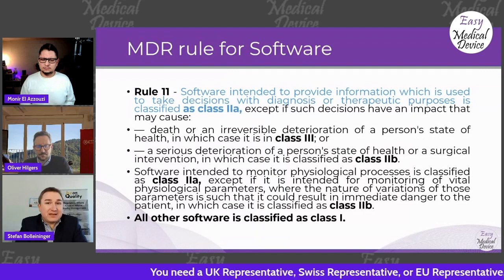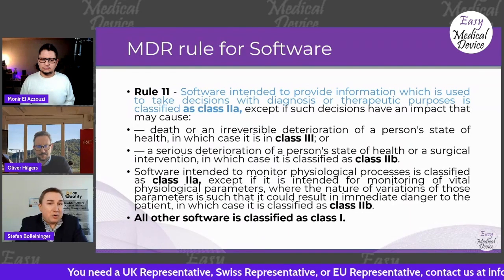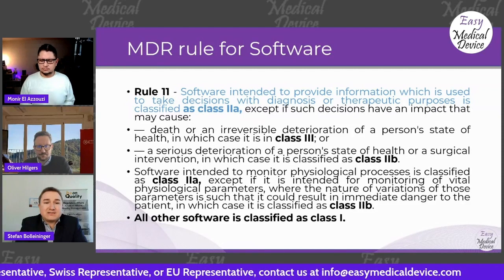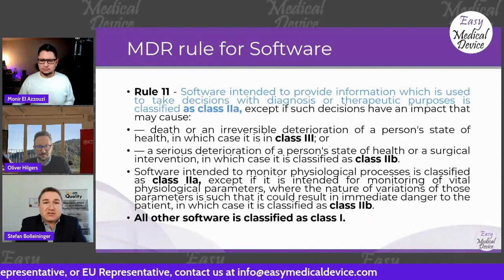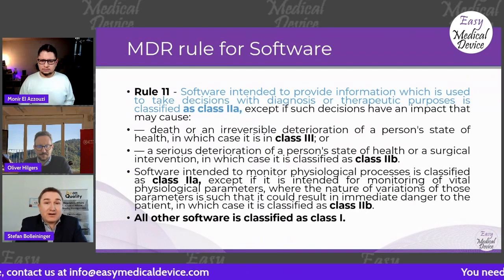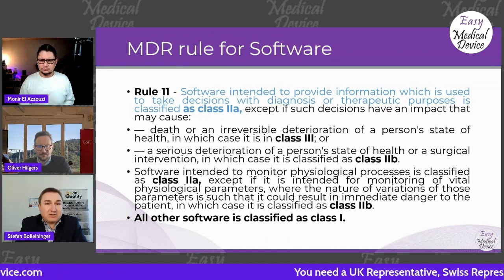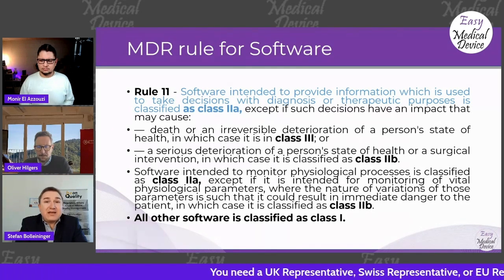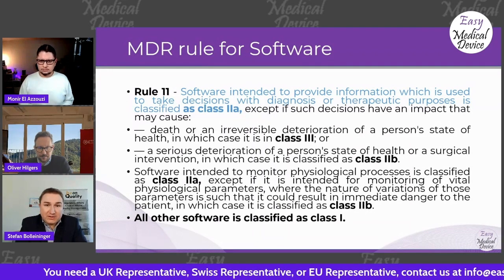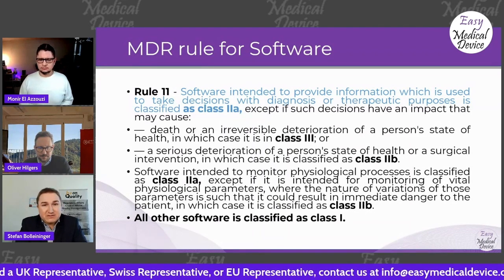And that means you need to have someone who has the competence, the knowledge, and the awareness about taking a therapeutic or diagnosis decision. And that is our first attempt, where I very strongly believe this is one of the main things we need to encounter. And based on that, it is up to the manufacturer to decide, okay, is my software for diagnostic and therapeutic purpose or not?